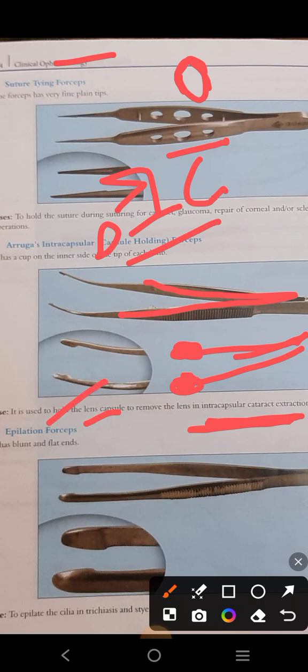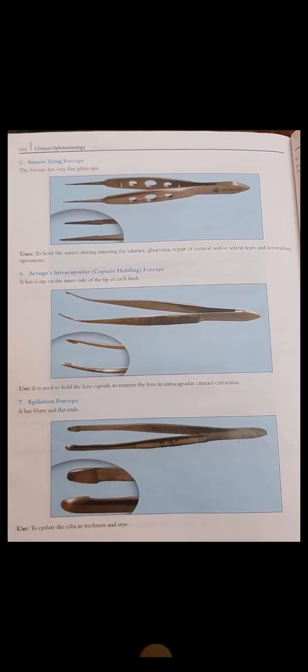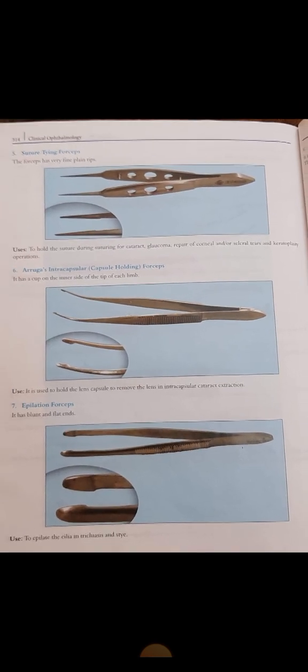The epilation forceps has blunt and flat ends. As the name indicates, it is used for the epilation purpose — removal of eyelashes. For example, in trichiasis there is an abnormal row of eyelashes grown, and you want to remove those eyelashes, so you use epilation forceps in that case.